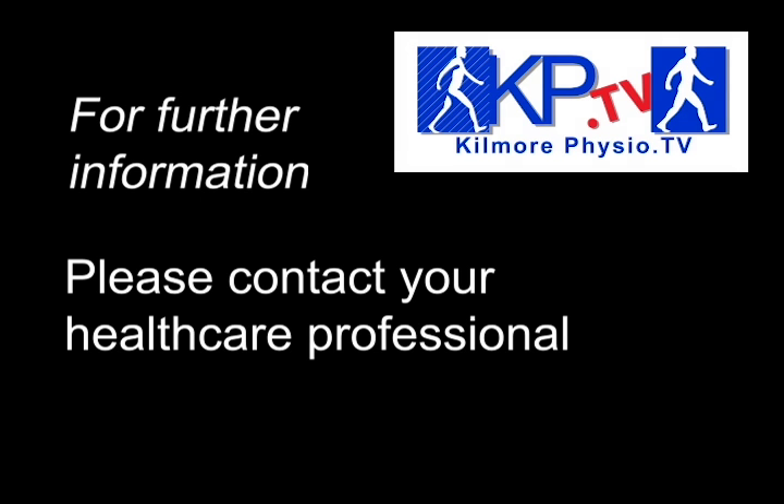These instructions will have you walking safely and comfortably with your crutches. If you are unsure about anything with your crutches, please contact your healthcare professional.